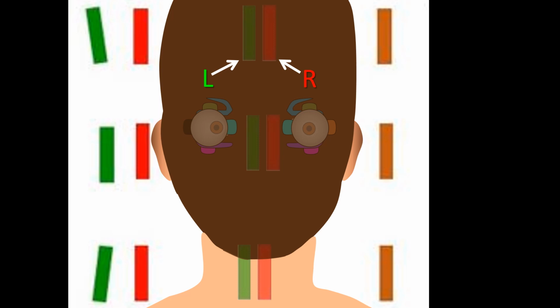In this frame, I am indicating this arrangement by the white arrows from the letters going towards the bars during elevation. The green bar is on the same side as the green crystal, represented by the green letter L, and the red bar is on the side of the red crystal, represented by the red letter R. That is so during levoelevation, as you can see indicated by the arrows, as well as in all other cases. This bar arrangement is called uncrossed diplopia.